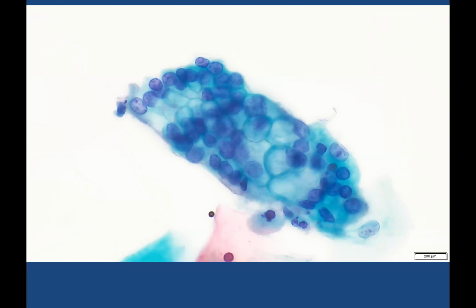You can see the same case, a different area, and although we can see well punched out and discrete glandular cells with obvious mucin on a Pap, you can predict that this would be mucin within the cells. Their arrangement is not normal. If these were normal endocervical cells in a normal honeycomb, we would see the nuclei regularly distributed across the full area of this cellular group.